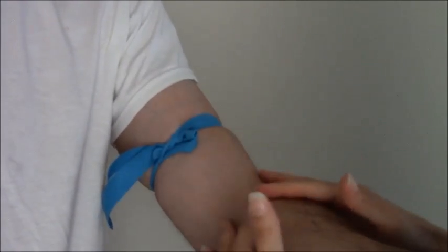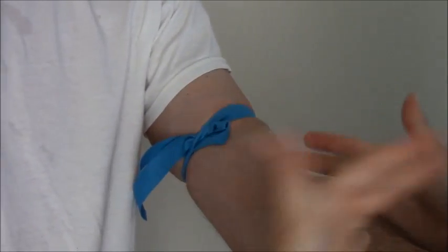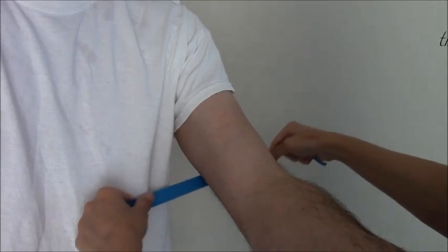Then you start your IV, draw your blood, and when you're done, do the quick release — just pull it like so and it comes off. Now I'm going to show you how to do it really fast, because that was sort of slow motion. This is what it looks like whenever you do it naturally.